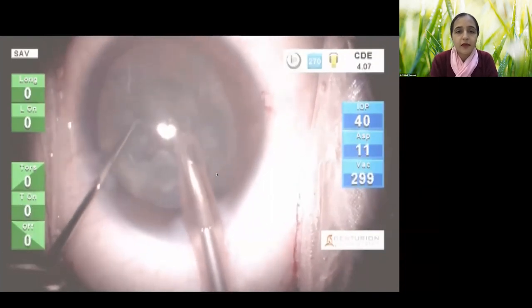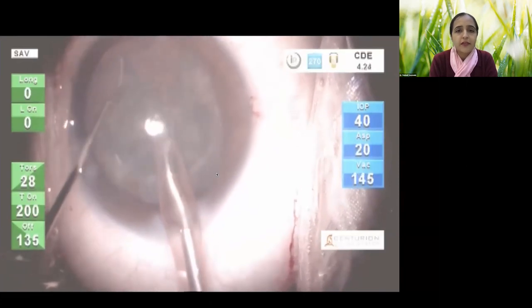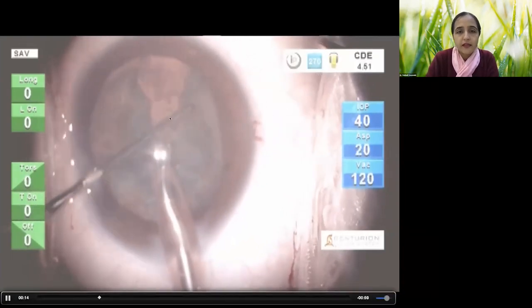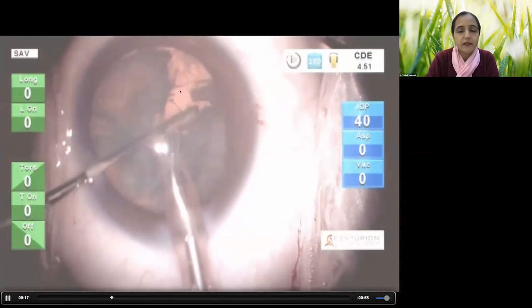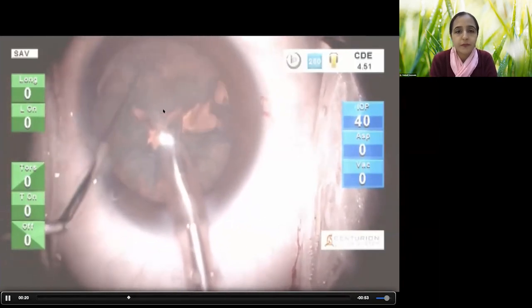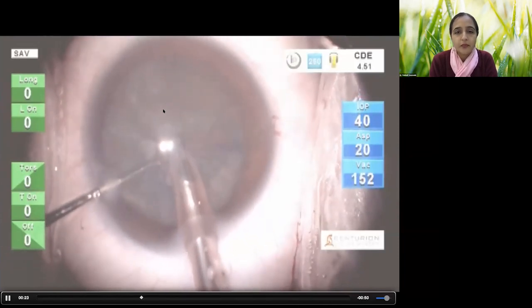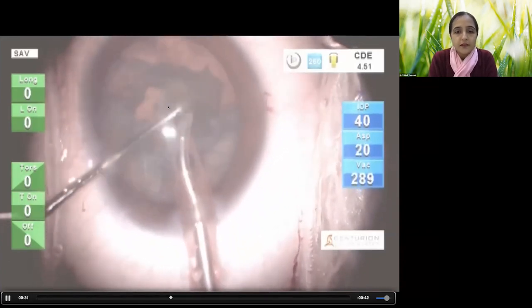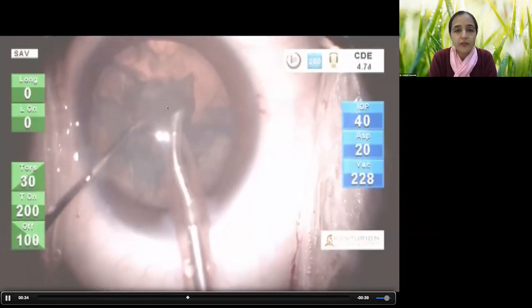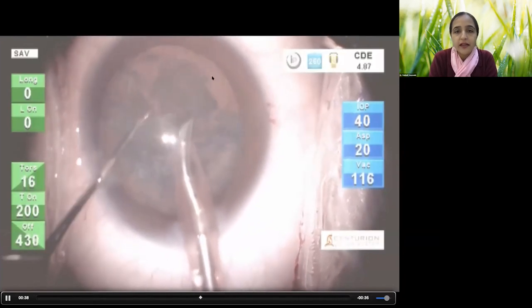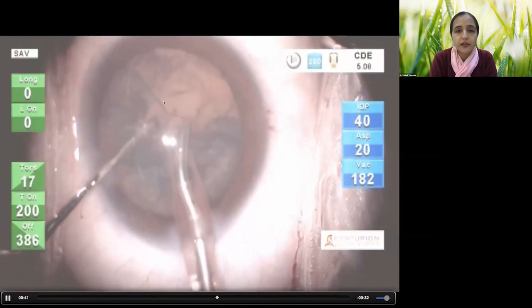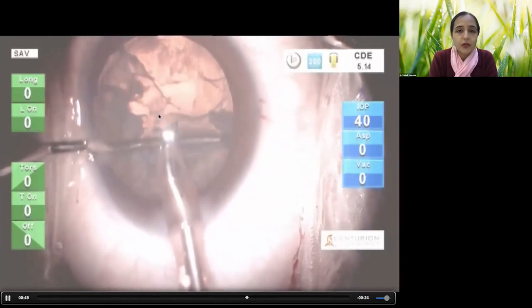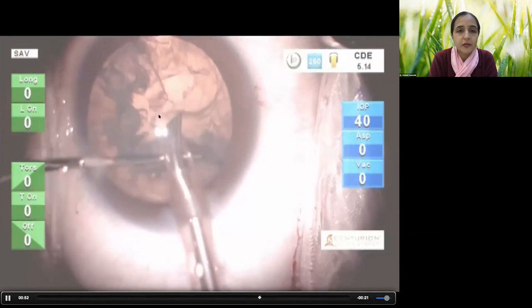Now the removal of fragments has started — modest parameters, everything looks in control, the anterior chamber isn't fluctuating too much. But keep your eye open on the side — something seems to have come up, though the surgeon hasn't noticed yet because the nucleus is rotating smoothly and quadrant removal is being performed. As more of the nucleus is removed, things become clearer — by now most of us can make out an area of posterior capsule rupture, and it is only now that it actually becomes clear that something is going wrong.